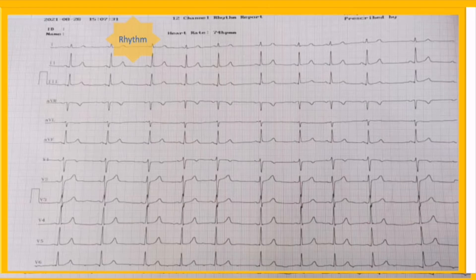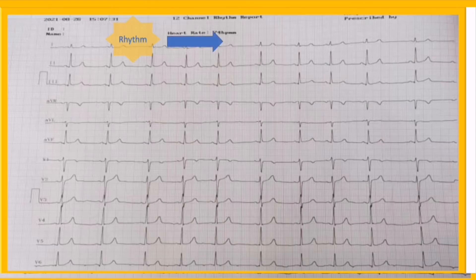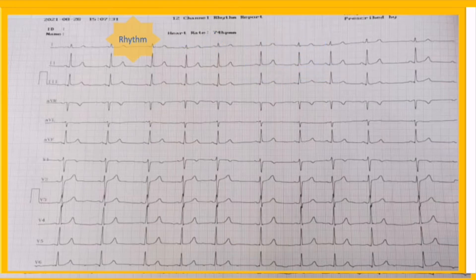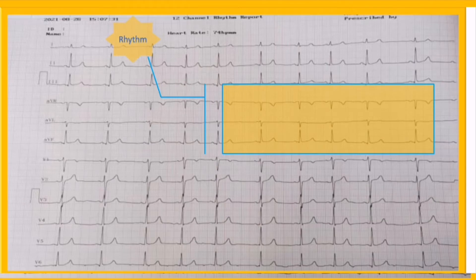The prerequisite for rhythm analysis is examining P waves and QRS complexes, but not necessarily in detail — we will talk about P and QRS in the fifth and seventh steps. In general, cardiac rhythm is classified into two main groups: regular and irregular. We define three independent steps for heart rhythm analysis. First: locate and examine P wave morphology.